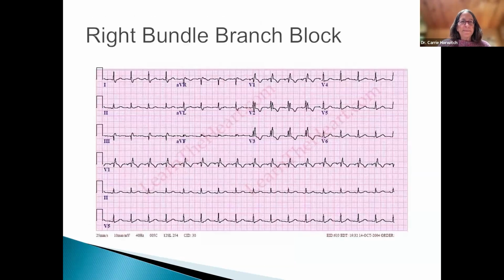Okay, so in bigger form, here's evidence of a right bundle branch block. Especially you can see looking at, say, V2 and V3, that you get the little rabbit ears. So you have two R's, RS, R prime on that. Next slide.